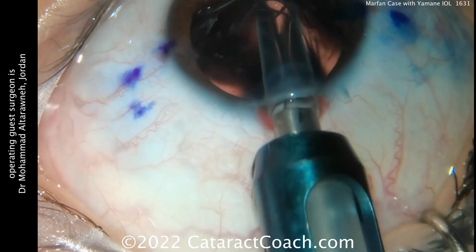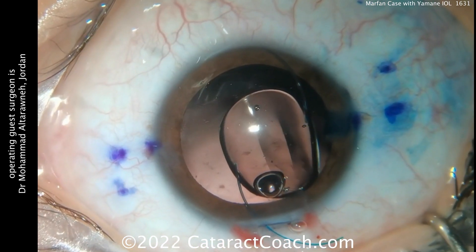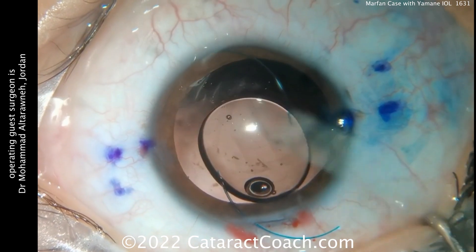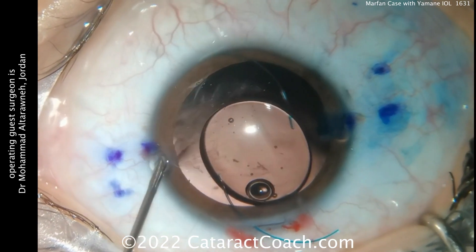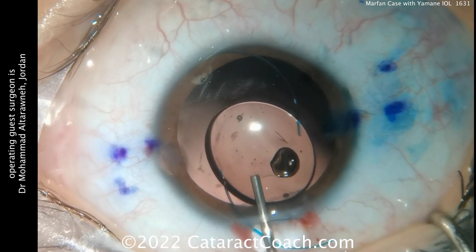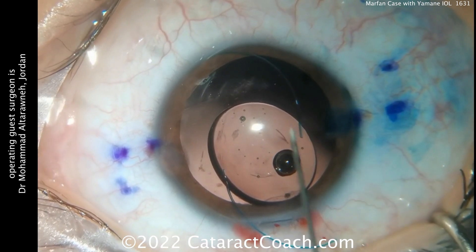Here comes a three-piece lens for the Yamane technique. The leading haptic goes inside the eye, there's the optic, and the trailing haptic is left outside the eye. You can put a little more viscoelastic to keep the anterior chamber maintained and formed. Now it's time to place the needles to bring these haptics out through the sclera — intrascleral haptic fixation.